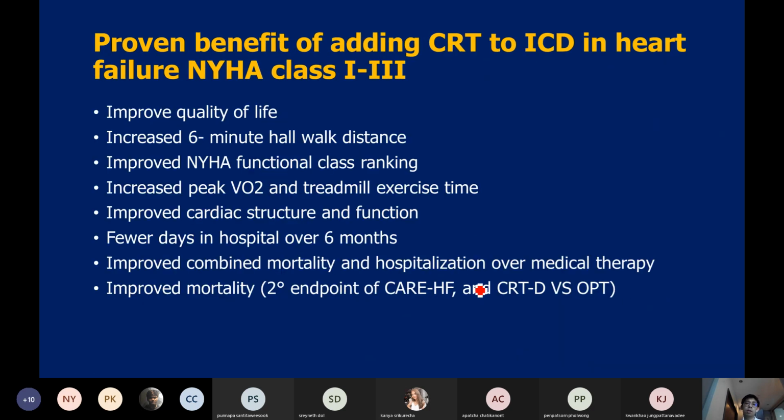And this is the proven benefit of adding CRT to ICD in heart failure patients. The CRT would give synchronicity and increase the cardiac output. It would improve quality of life, increase 6-minute walk distance, improve functional class, and also improve peak VO2 and treadmill exercise time, and improve cardiac structure and function.